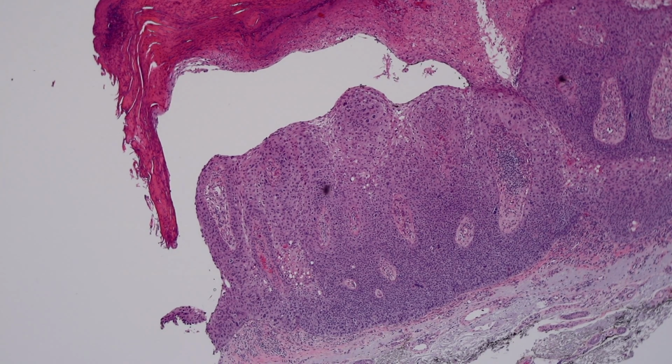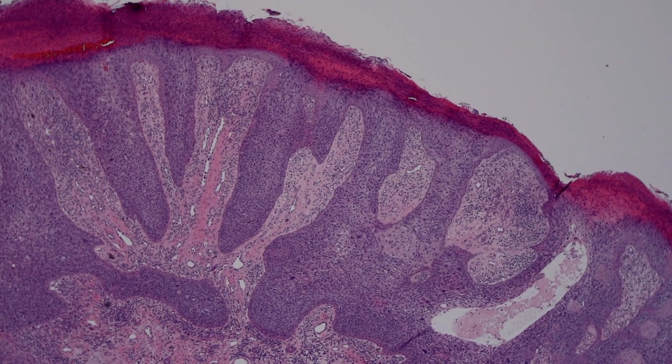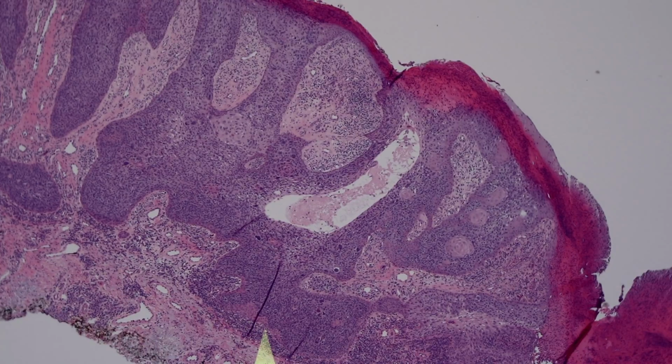When it fills up a lot of the epidermis, it does so with a bunch of nests, and it leaves normal keratinocytes scattered in between. And then over here, you can see, again, even from low power, I think you can appreciate the eyeliner. See that little line right there? That's eyeliner sign. There's a little line down here too. It can be a little subtle, but with practice you can learn to pick it out, and it's quite helpful.